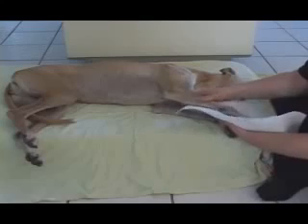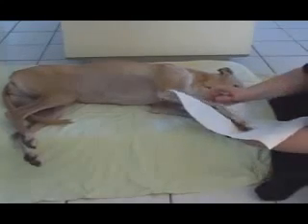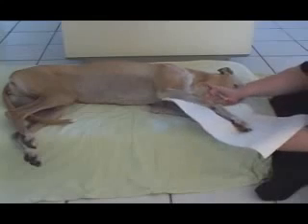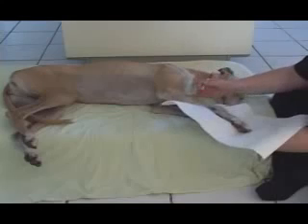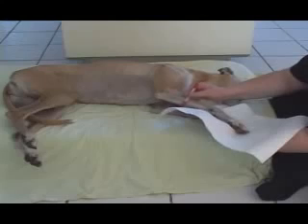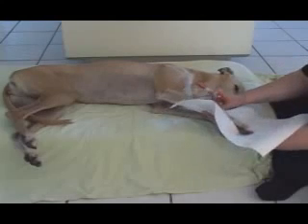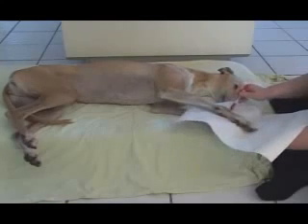The pattern is most easily made when the animal is lying down. Place a few sheets of paper towel under the animal's limb. With the magic marker, trace the shape of the limb. The tracing should go up about two-thirds the length of the ulna and should be made wide enough to go about half of the circumference of the limb. Make sure that the distal part of the pattern is large enough to accommodate the animal's foot, allowing enough room for the toes to abduct when the animal bears weight on that foot.